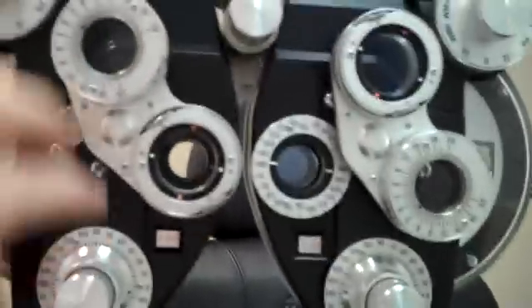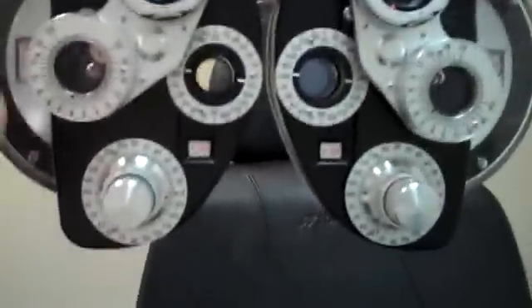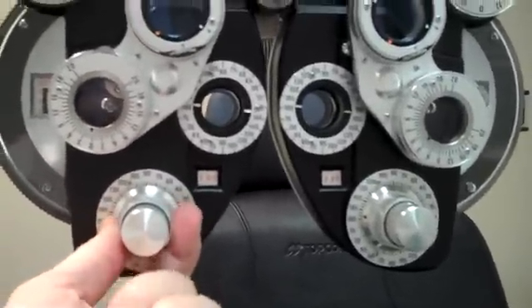So after all the one, two back and forth, that's going to tell me how much power you need, how much astigmatism power you need, and what angle it's going to be. Now remember, you're looking at any line. Some optometrists have you look at the smallest line possible, some look at a bigger line — wherever you can tell a difference. If you can tell a difference between one and two, let us know. If you can't tell a difference, say that. Then we'll be able to nail down that prescription really precisely, custom to your eyes.